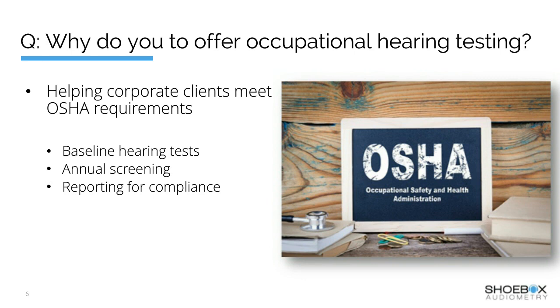some gold standards. So OSHA has these regulations by which you test the hearing of the employees on a regular basis upon employment, and then annually thereafter, and then upon change of environment, job description, or workplace, if you will. These are requirements that many of the companies and clients we serve have as standard laws, rules, regulations, and requirements by OSHA. So this is one of the needs of the industry to provide audiometric testing. Absolutely, absolutely. I think you've summarized that quite nicely.